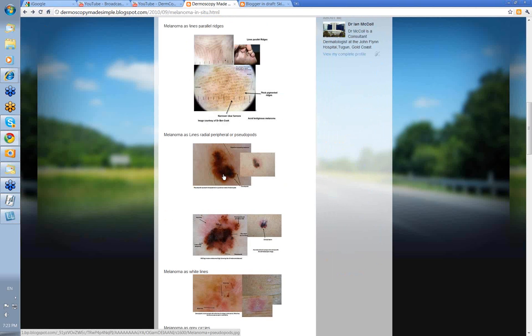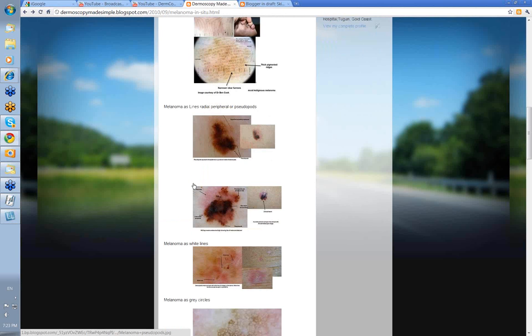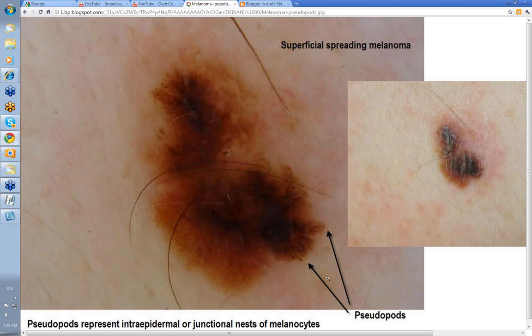What about lines radial peripheral or pseudopods? There are your lines radial peripheral — again, very obvious melanoma. Pink area here corresponding to this area with the pink dots, some pseudopods and peripheral dots out here, blue-black structureless, and some pseudopods down here. Let's concentrate on the lines radial peripheral. This one here was mainly to show the pseudopods, with a lot of pseudopods indicating cells at the dermoepidermal junction even up into the epidermis growing. It represents intraepidermal junctional nests of melanocytes — again, very obvious melanoma.